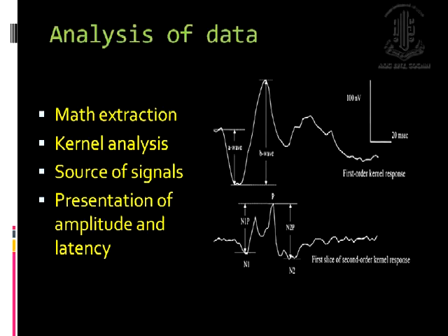Now, when we are talking about the presentation, we have to keep in mind that the presentation of the signal is mainly topographic, meaning that you need to see the amplitude and the latency in comparison to spatial degrees or spatial parts of the retina. What's the periphery to the center? What's this degree to this degree?